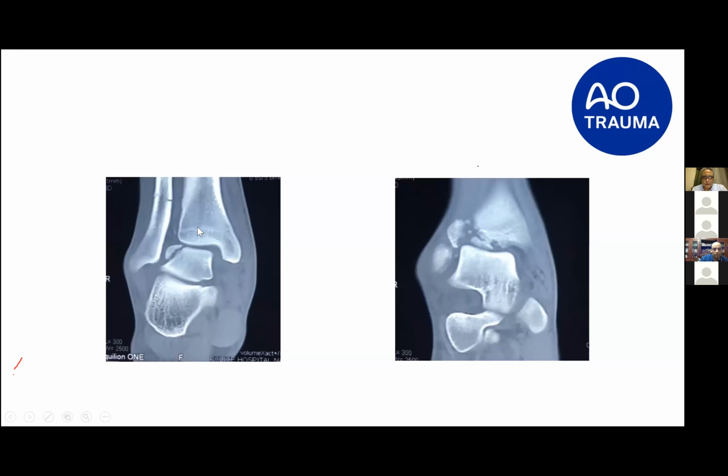Syndesmotic injury. I think, what do you think about the syndesmosis here? Yeah, it looks separated now, and there is syndesmotic injury, definitely, yes. And I think also the medial clear space is a little bit wide here. Medial clear space is wide as well. And we have also a fracture here in the most anterior part, so maybe distal tibial fracture or talus.